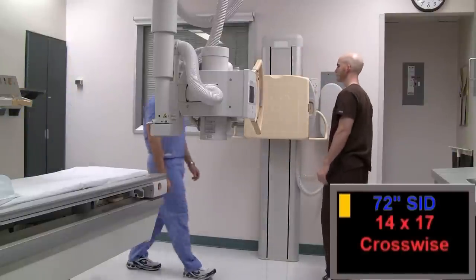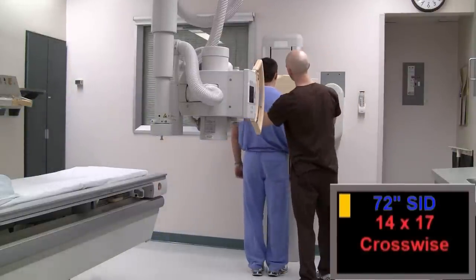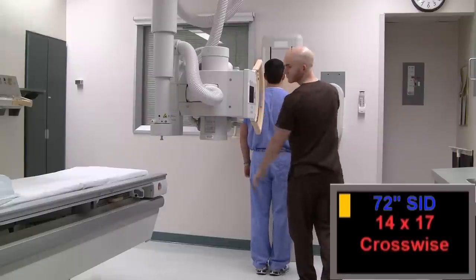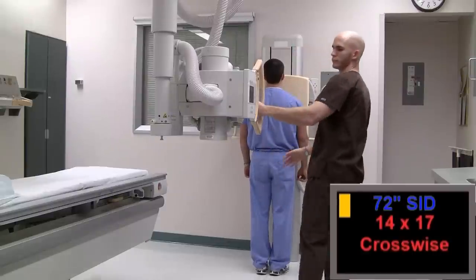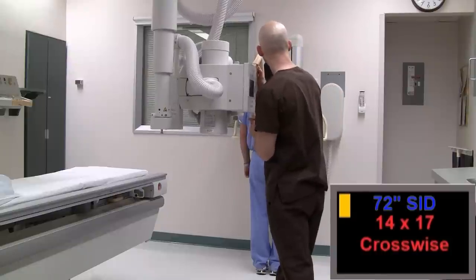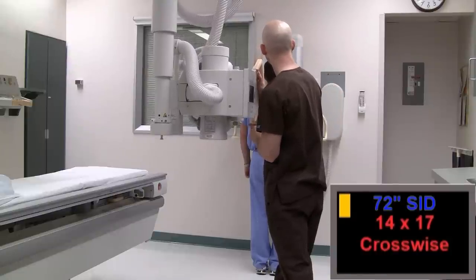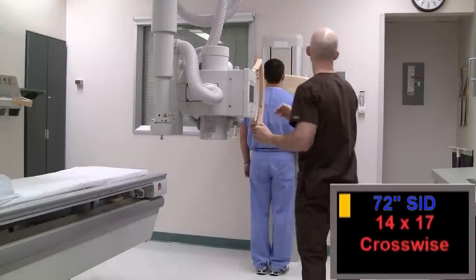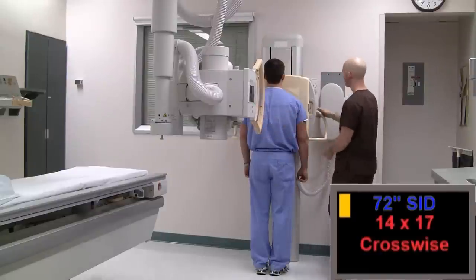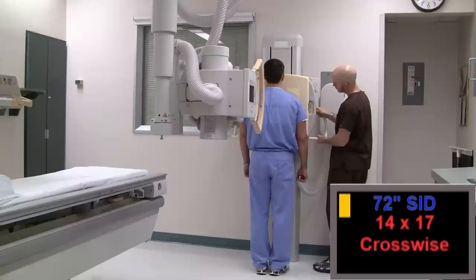Now position your patient by having them stand with their chest against the wall bucky. Make sure their chin is elevated. Re-center the image receptor to the central ray. Place the top of the film one and a half to two inches above the shoulders.